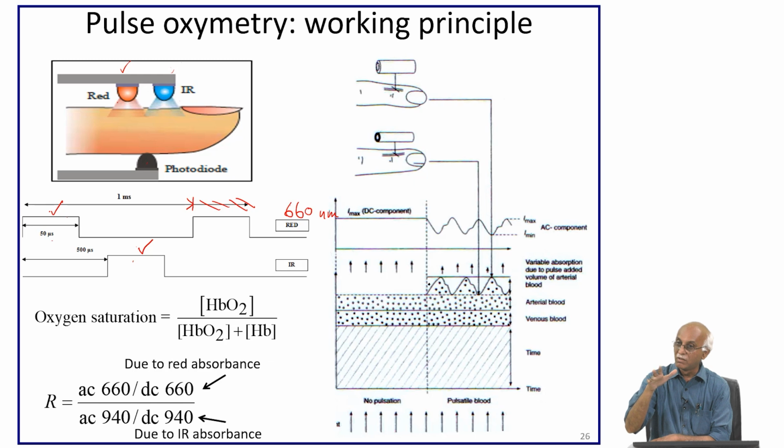If you see the heart ECG waveform, it takes around 800 millisecond to complete one waveform. That means one pump cycle is of the order of 700 to 800 millisecond.